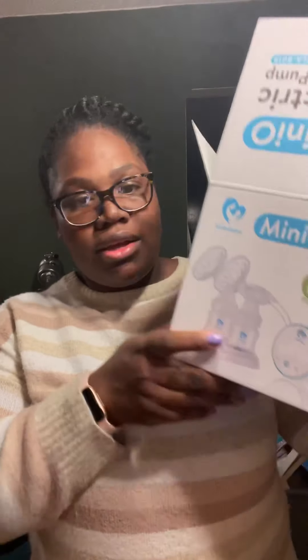If you've been watching before, you know I've been using the legendary milk collecting cups and my Bella Baby pump. In the last video I told you I found the Bella Baby Mini pump, and of course I got it. So I'm about to unbox the Bella Baby Mini.